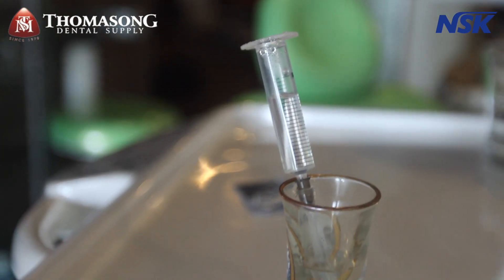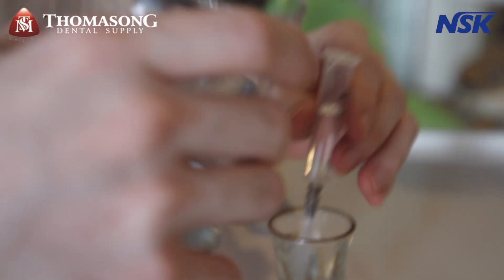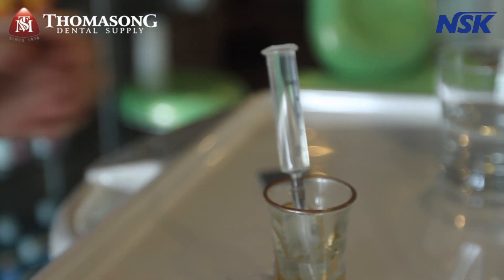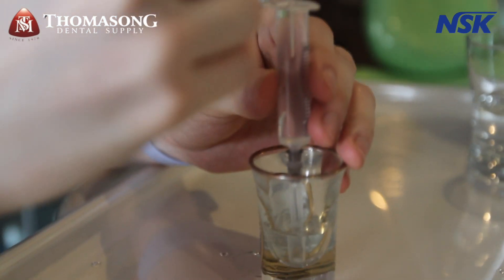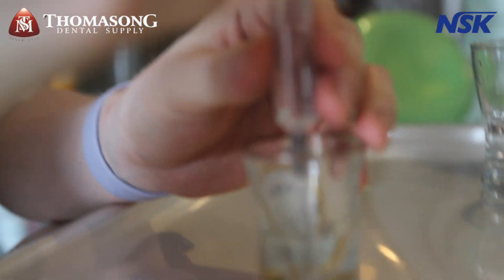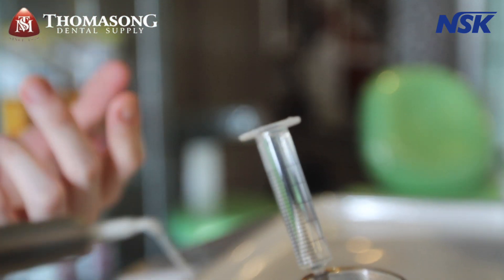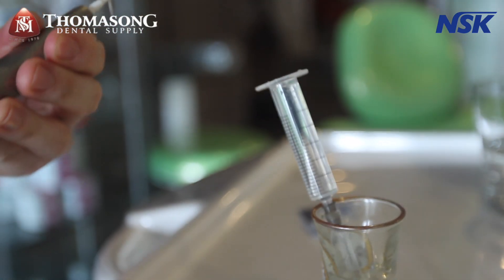Let me add a bit of water — okay, there we go. This is at the low setting. You can see it's not creating so many bubbles at low, but this is already very powerful compared to something like an endo activator, which uses vibrations from electricity. This uses vibrations from air, which is much more powerful.